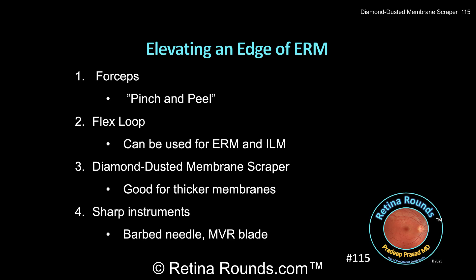However, for thicker membranes, a more robust tool like the Diamond Dusted Scraper can allow for more efficient elevation of an ERM. And for very tightly adherent membranes, sometimes sharp instruments are needed to incise the membrane and to sharply dissect between the plane of the membrane and the underlying retina. For this, a barbed needle works quite well.